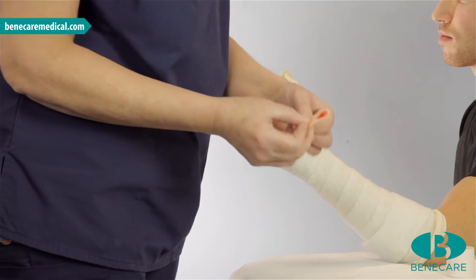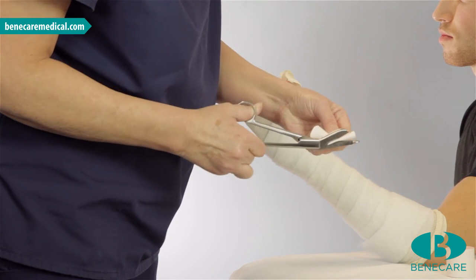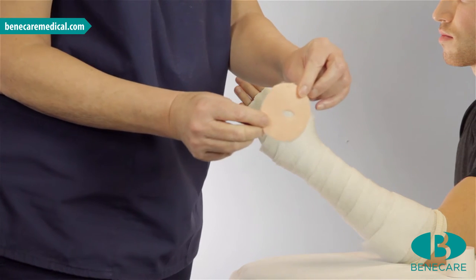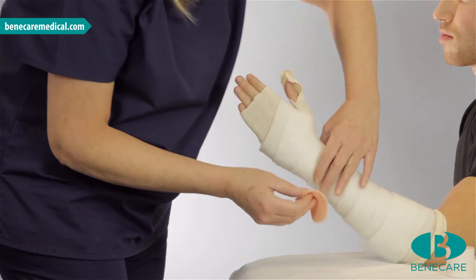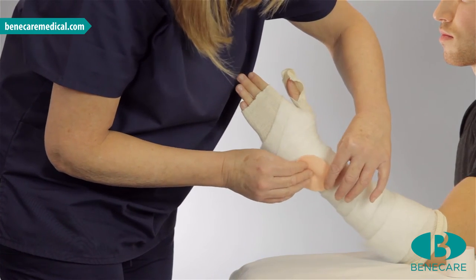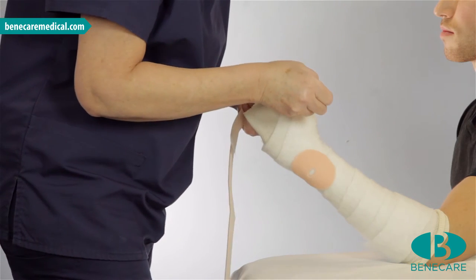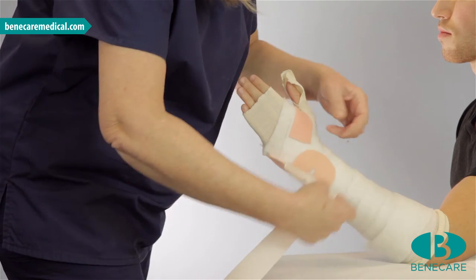If you have a patient with vulnerable skin, I would suggest fleecy web for additional protection over bony prominences and sensitive areas. I am applying a small circle that I have pre-cut over the ulnar styloid and a strip around the distal aspect of the hand that I will trim to fit into the web space.